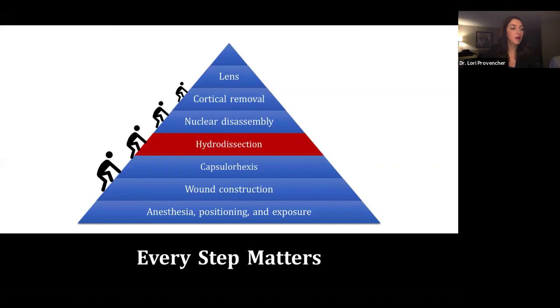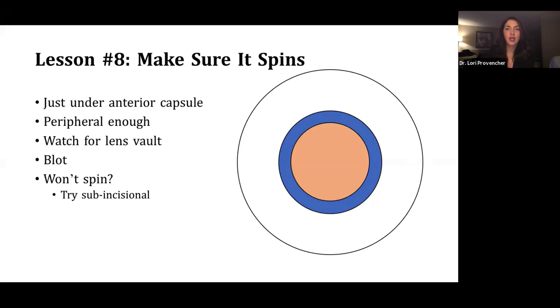So we'll continue to move up our pyramid here. Hydrodissection. This is something I found to be challenging, and I always thought it would be a simple step. But hydrodissection is really crucial, and you should avoid with all you can to go on to the next step until the lens is really spinning well. Tips for this, I would say make sure you're just under the capsulorexis edge. So when you go in with your BSS cannula, make sure you're lifting up just a little bit to make sure you're just under the edge and you get true cortical cleaving. You want to be peripheral enough so that the BSS is directed towards the equator.